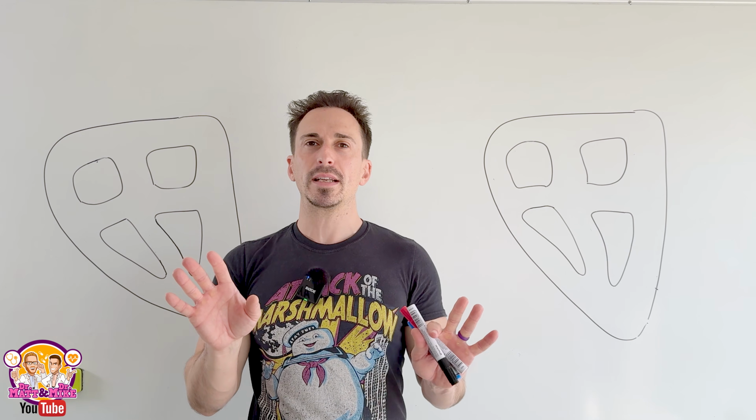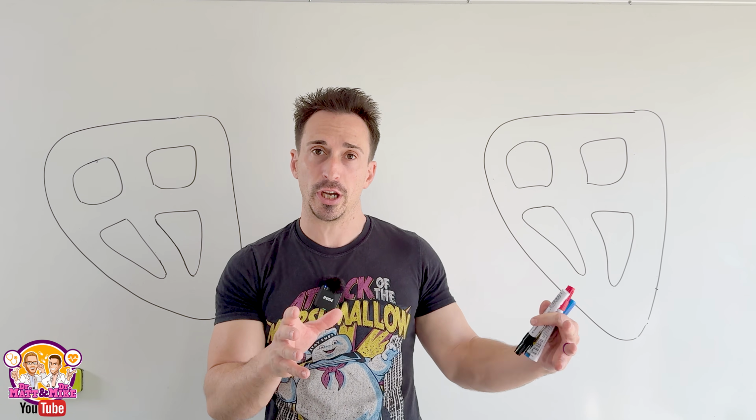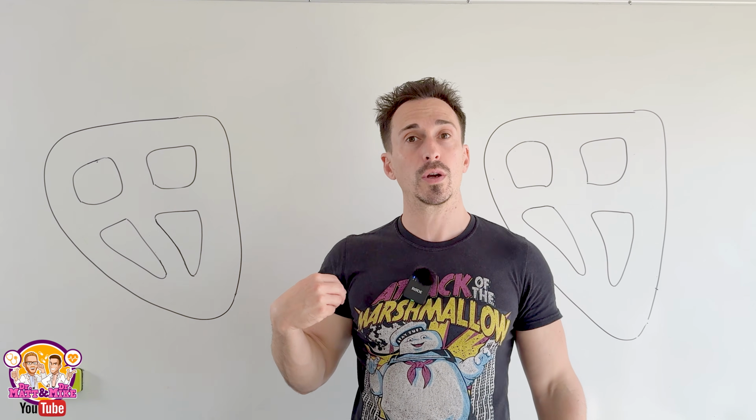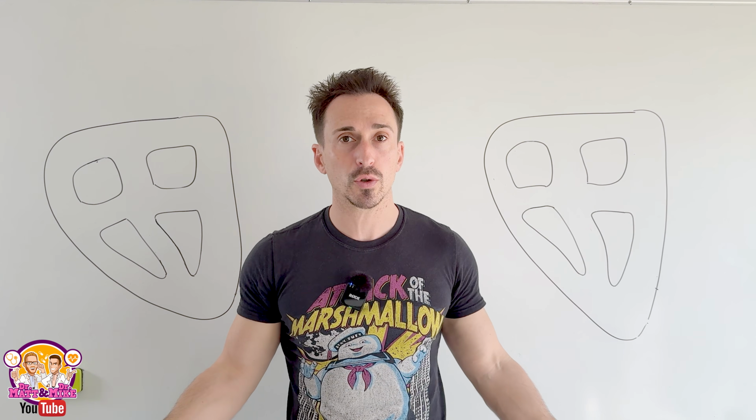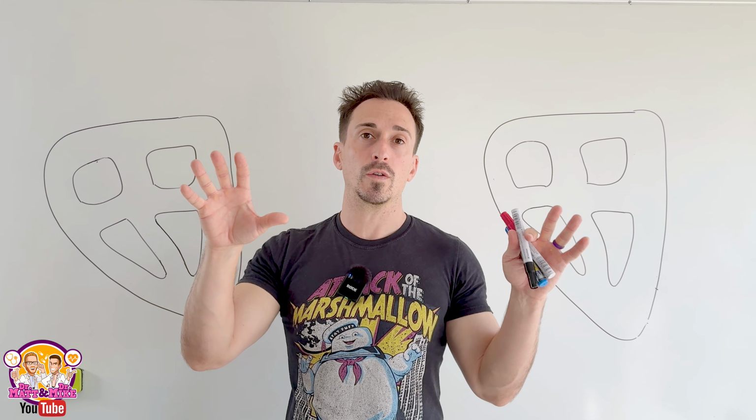All right, to begin, we need to just do a little bit of background so that we're all on the same page. We need to understand the ECG. So we know that there's these sticky dots that we put on our chest called the precordial leads, and those that we put on our limbs called the limb leads, and they give us 12 separate views of the heart, which we call the 12 leads.